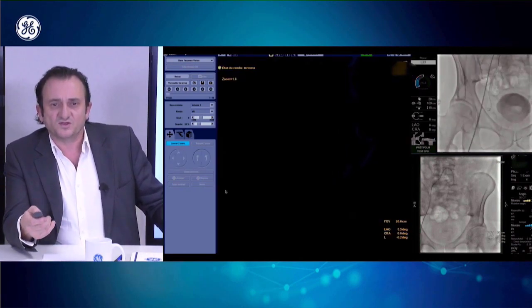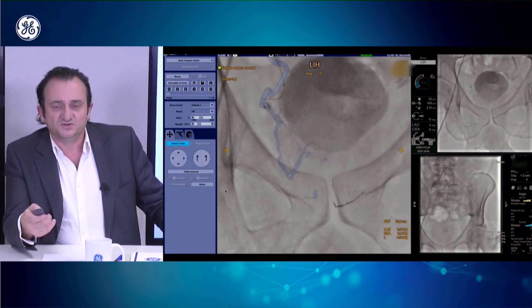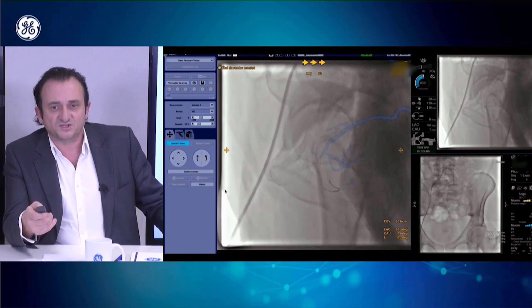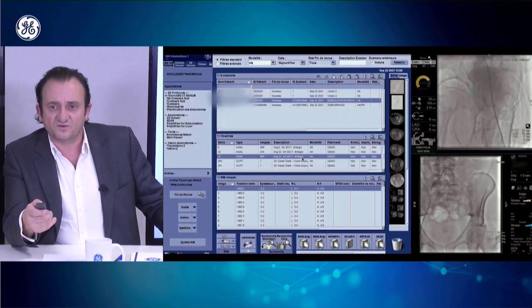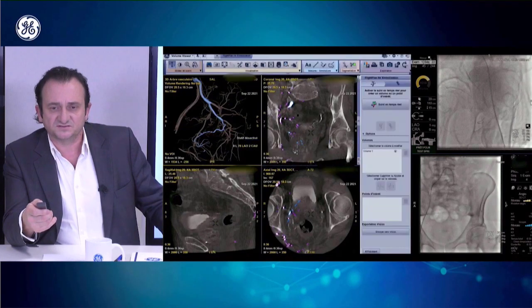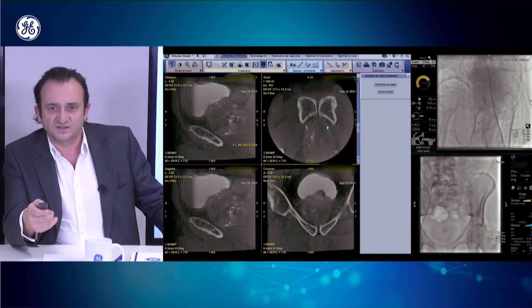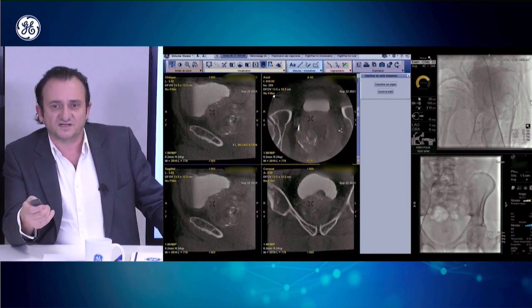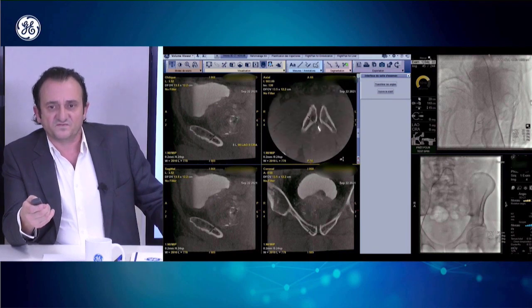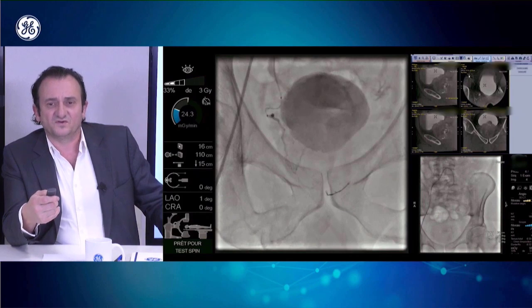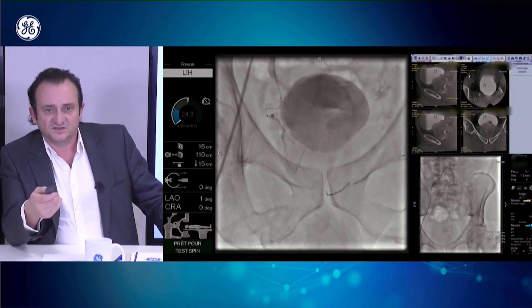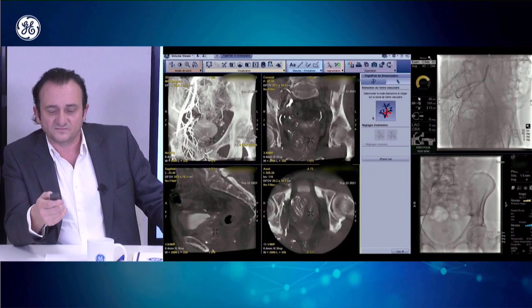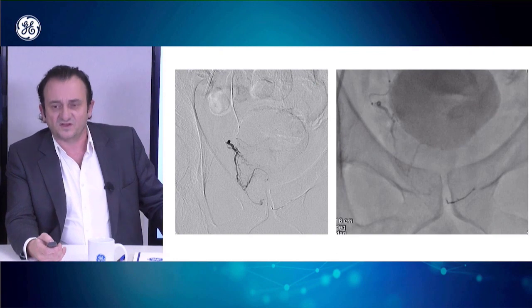Here with the microcatheter you have the wire passing into an artery which is not the correct one, but you can come as close as possible to these divisions, then change the orientation of the microcatheter and microwire to select the prostatic artery. This 3D CT roadmap is very useful for embolization. When you are ready, you can perform a 3D CT to confirm that only prostate parenchyma is being embolized. The left shows the coils and the right shows only prostate parenchyma.